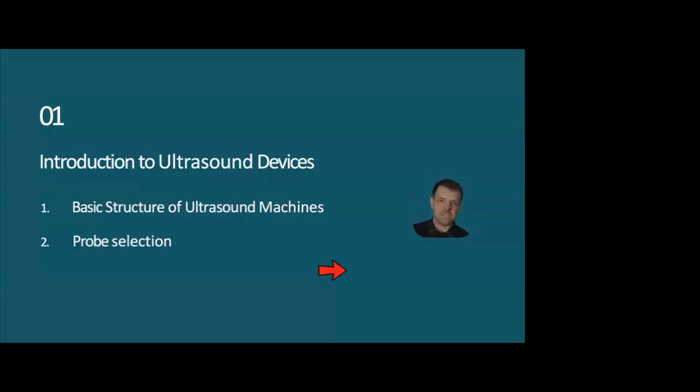If you just want to see whether the Achilles is still attached and to what extent it's still attached, then a handheld probe is usually pretty good. You can get fairly decent images, but the kind of quality is very different between the devices, and that is borne in the price that you're going to pay. So the handheld devices are around about £2,000-3,000. Sometimes they're a little bit more, and you're looking at least sort of 10,000-12,000 for a decent laptop. So again, obviously, it's a big investment if you're going to go for it. So it needs to be something that you're going to use, and hopefully, I'll help you get the best out of it today, or at least give you some ideas about which one to choose.